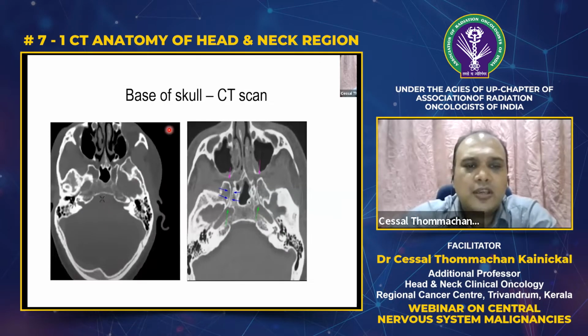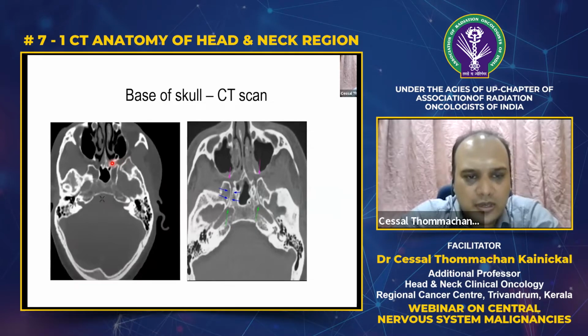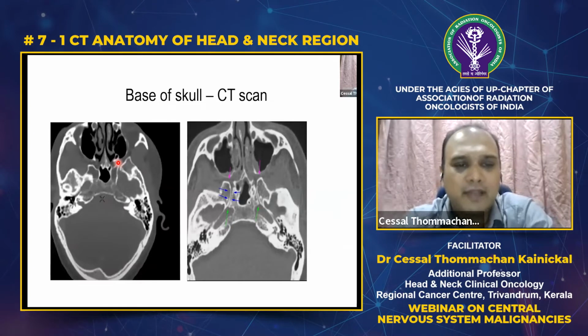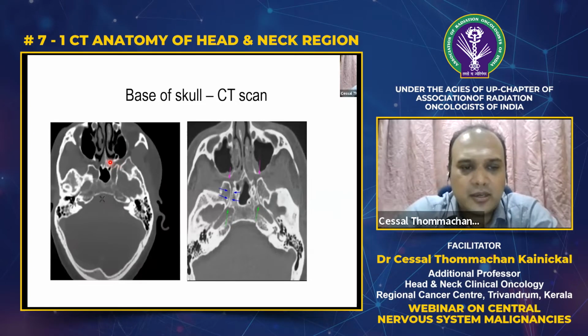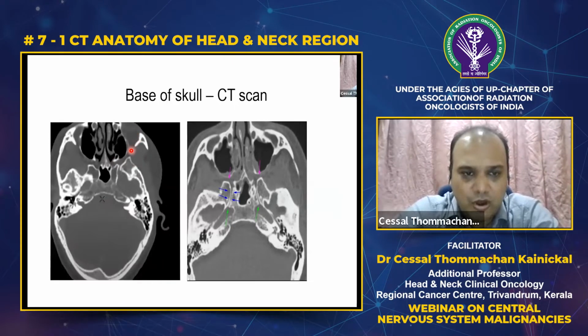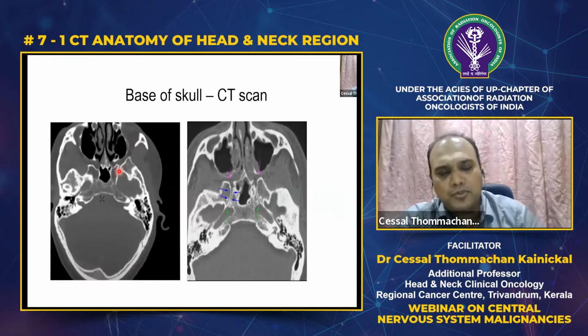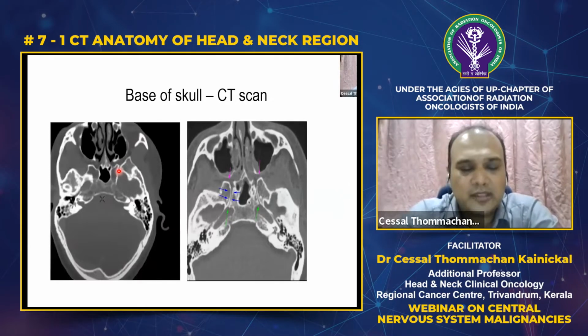So coming to the foramen rotundum, this is the pterygopalatine fossa. Pterygopalatine fossa is a crossroad, as it's a junction where you transmit many structures from the oral cavity. From there, it can go to the nasal cavity, the infratemporal fossa, and into the orbit, then into the brain. There are 3 posterior connections for the pterygopalatine fossa.